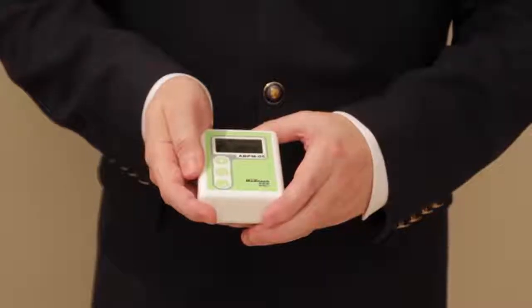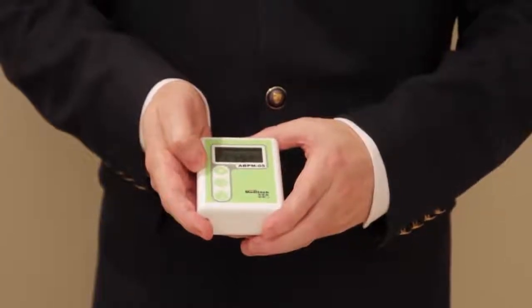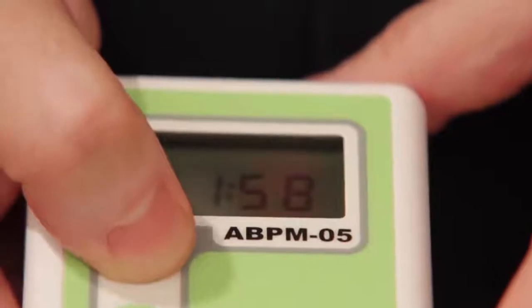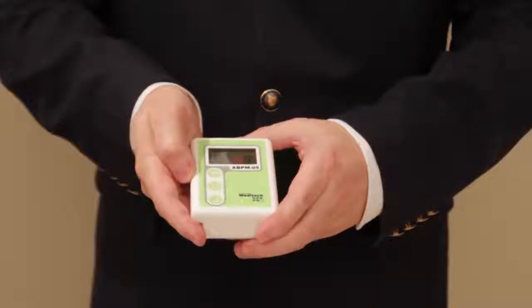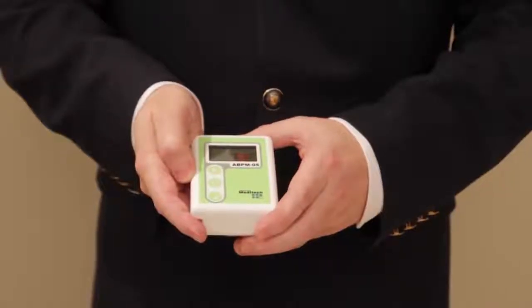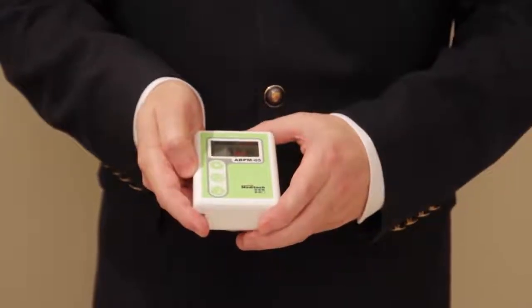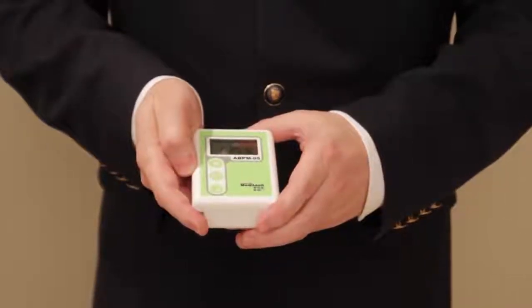So once the batteries are inserted, the time will be displayed on the LCD. If you press the start button to initiate an extra measurement, the device will show all segments on the LCD, then set to 0 pressure level and start pumping. If for whatever reason you wouldn't like to finish an ongoing measurement, press the same button again to cancel it. Then off is displayed on the LCD with multiple bleeps audible in the background. And this will not influence any following measurements in the plan.